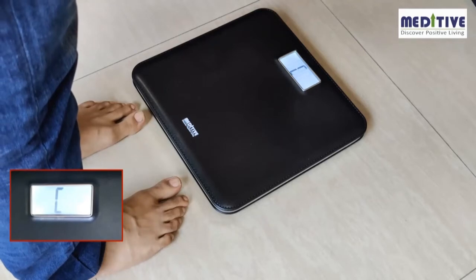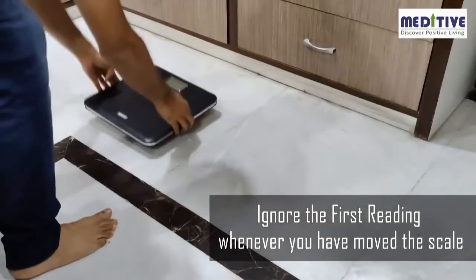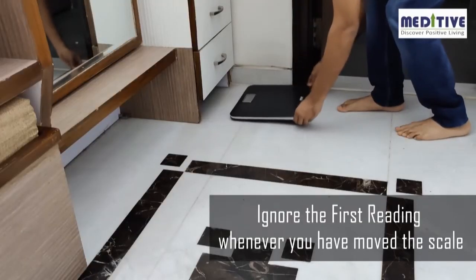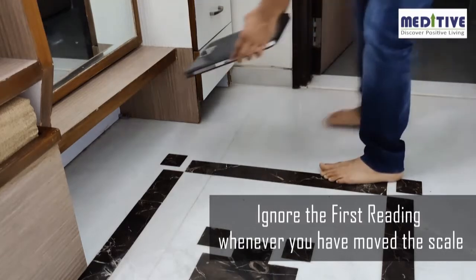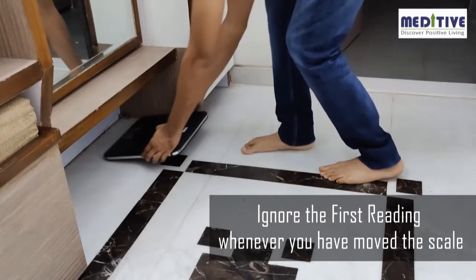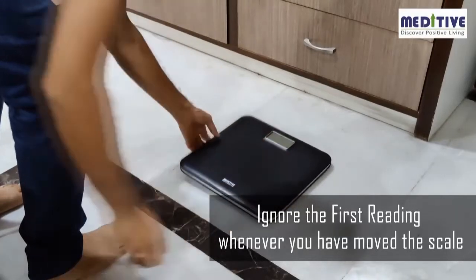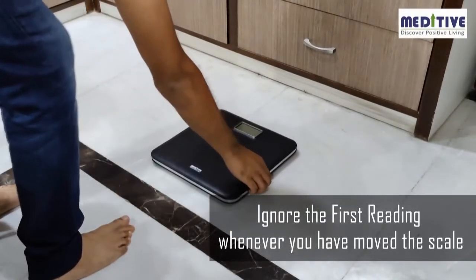Please note that whenever the letter C appears on the display, it means you need to take the weight measurement again. This may happen if you have moved the scale from its position — for example, if you keep the scale under a cupboard or table and then take it out the next day, or if you pick it up, slide it, or shift it on the ground. So every time the scale is moved, please ignore the first calibration reading and then take the second reading.